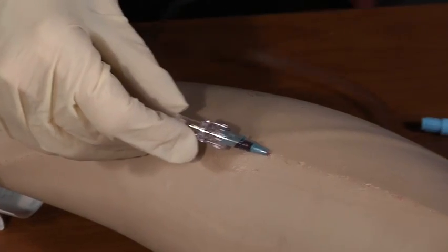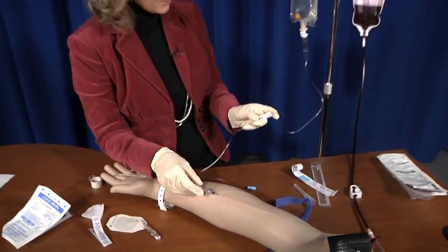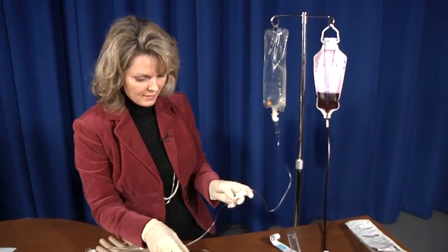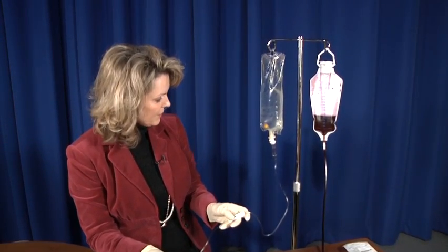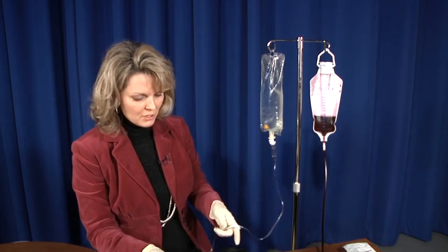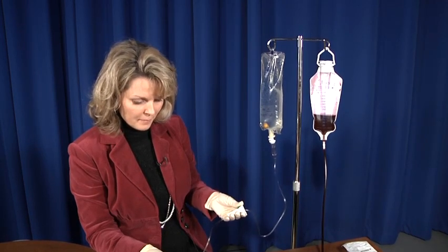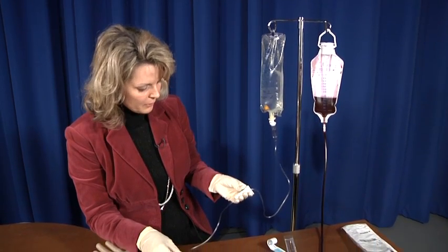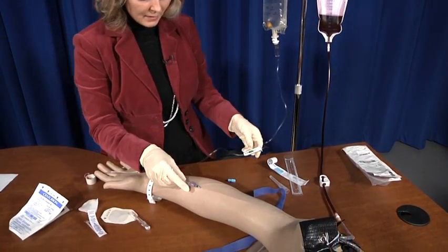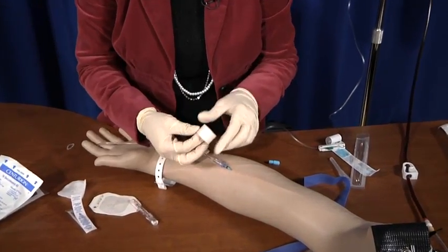So now what you want to do is make sure you're in the right place. And the way you do that is to take your roller clamp and gently start the flow. You're not going to see it on this particular mannequin because the pressure inside his artificial vein is greater. But if you initiate the flow, start it real slow, it'll open up and it should go through the valves and should flow freely. That's what you want to see. After you see that you're in the right place, you want to slow the rate back down. Don't cut it all the way off, just slow it back down. And now we're going to secure the site. We're going to do that with our tape.